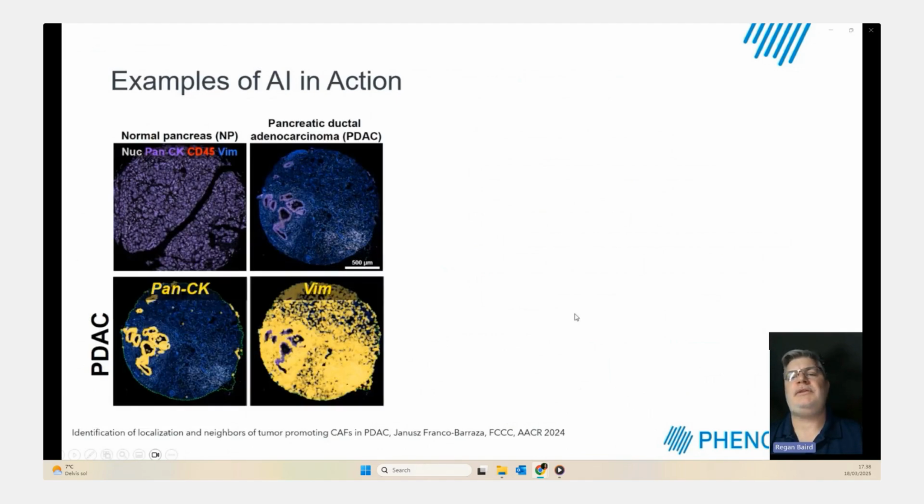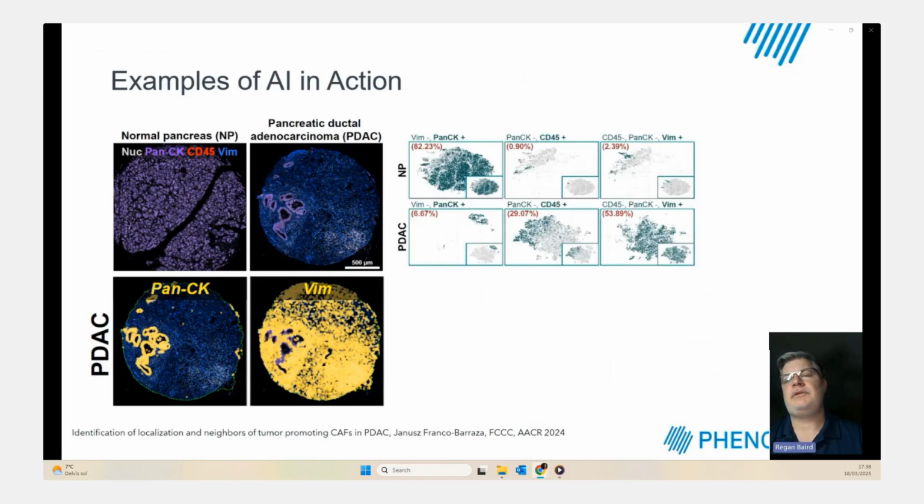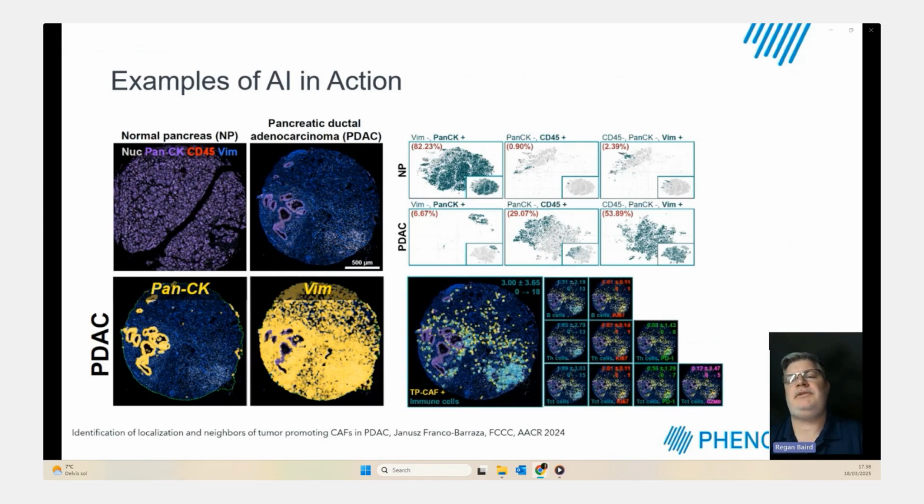One powerful application is in the tumor microenvironment analysis. AI can integrate transcriptomics and proteomics to classify different immune cell states within a tumor. This has major implications for immuno-oncology, helping us predict therapy response more accurately.